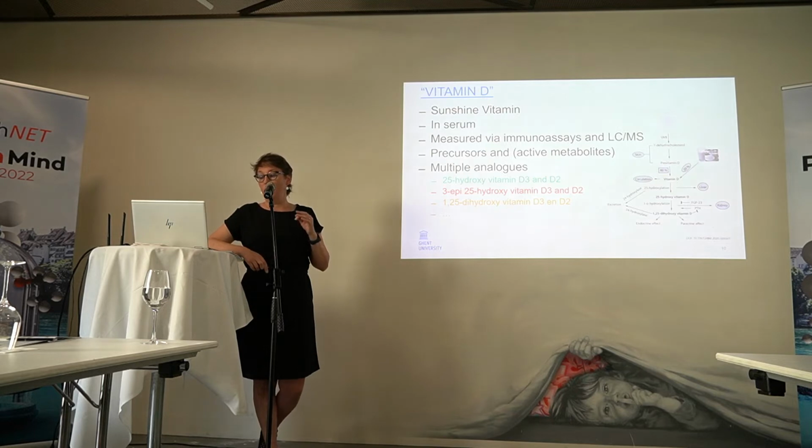It's inactive, and we would like to avoid measuring it. And then you have other analytes, also 24,25-dihydroxyvitamin D3 and D2, and these exist, we know it, and we try to give them some clinical relevance. We measure them in research settings, or when we have patients for which the clinical picture does not match the result. And this is something which is frequently done. We measure testosterone, but when testosterone is not really matching with the clinical picture, we will try to look at the testosterone metabolites.